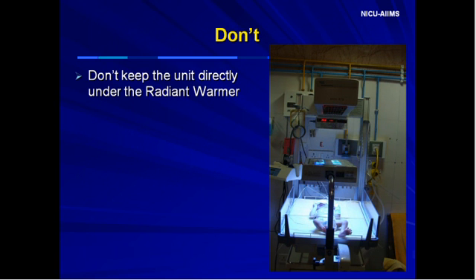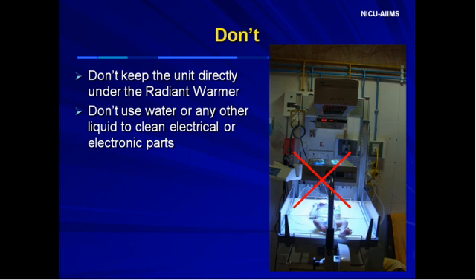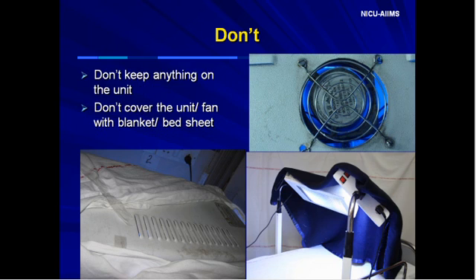Let us now learn some important points which need to be considered while handling a phototherapy unit. Do not keep the phototherapy unit under the radiant warmer. Do not use water or any other liquid to clean the electrical or electronic parts. Do not keep any liquid on top of the machine. Do not cover the fan or vents with curtain or blanket. These are meant for cooling the unit.